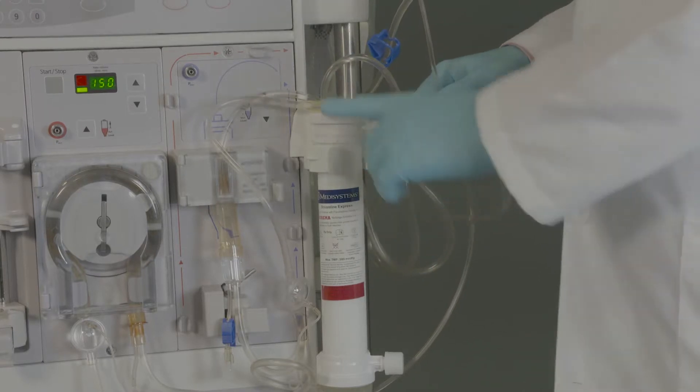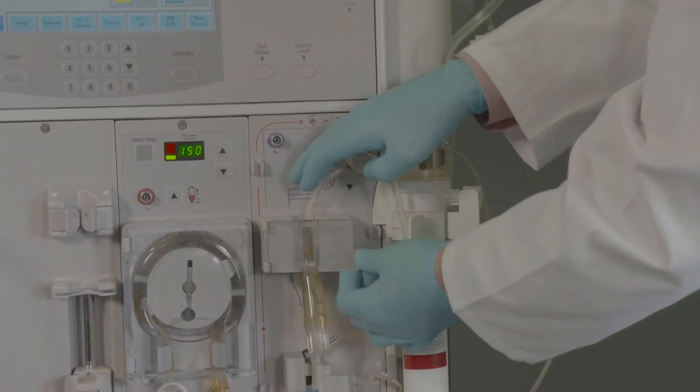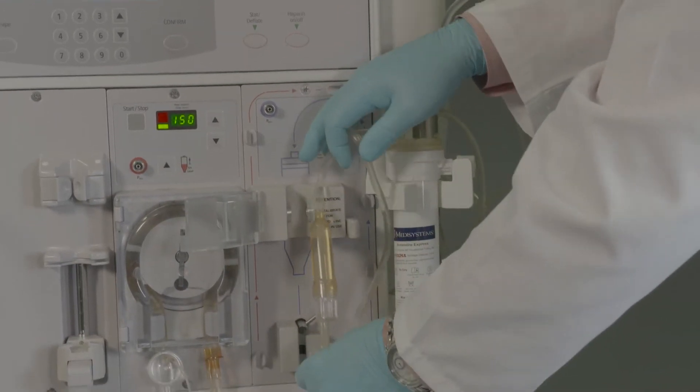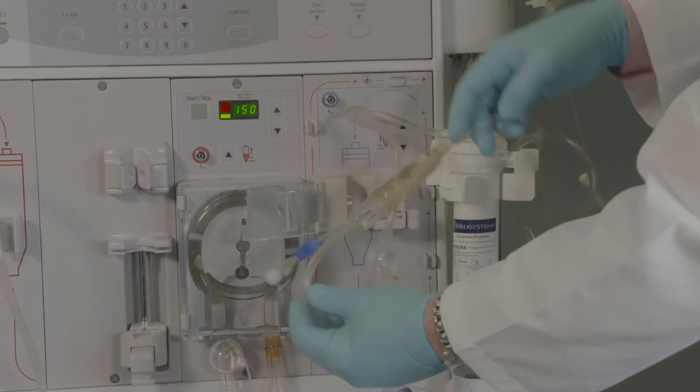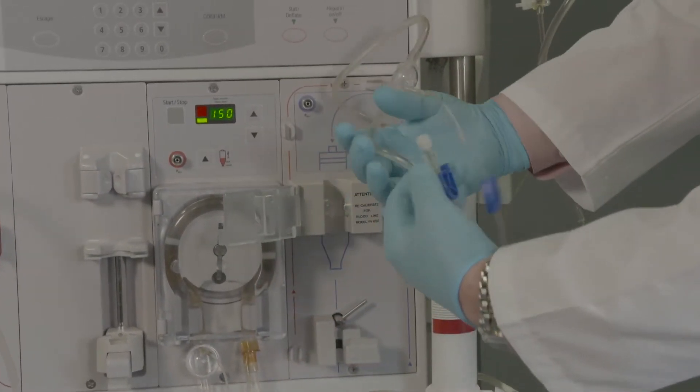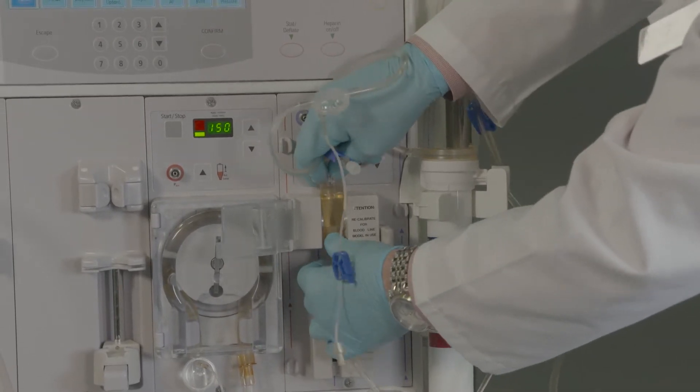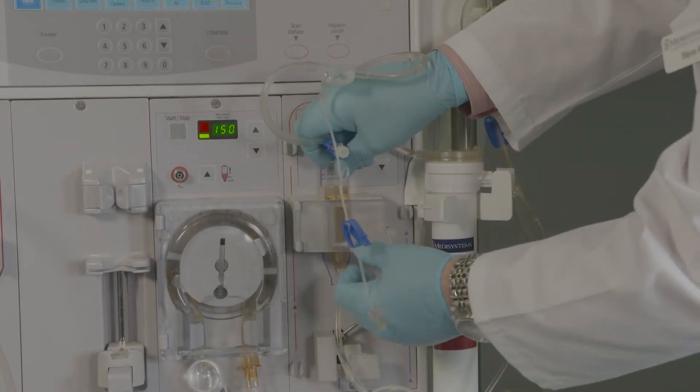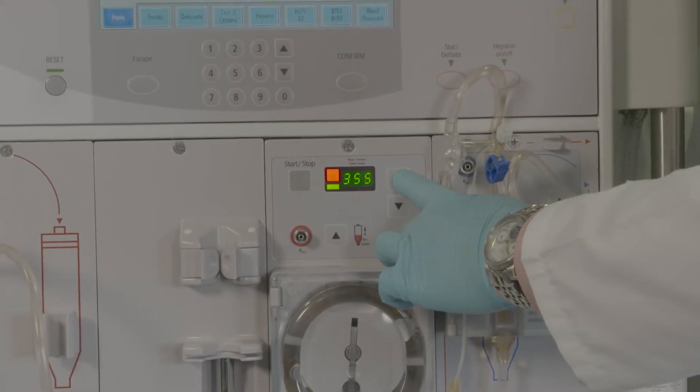Place venous chamber in upright position for recirculation, machine test, and treatment. At this point, the pump should be set for 400 milliliters per minute for recirculation.